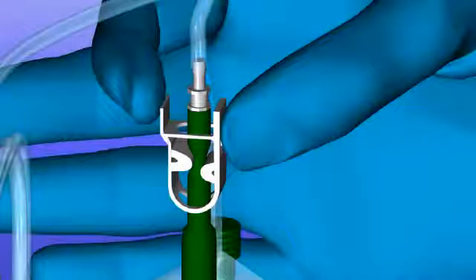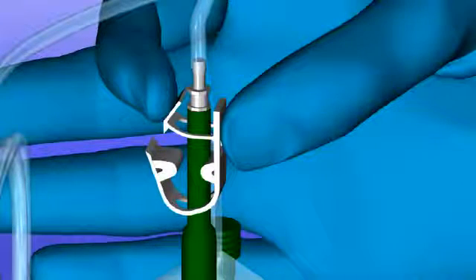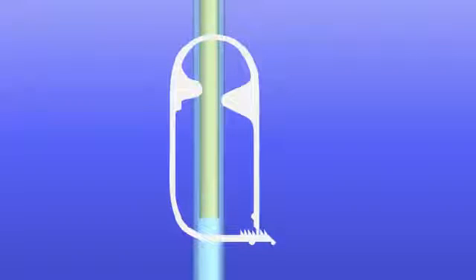Draining fluid into the bottle. Release the white clamp until it no longer pinches the green tube closed. Release the pinch clamp on the drain line slowly to begin draining fluid.